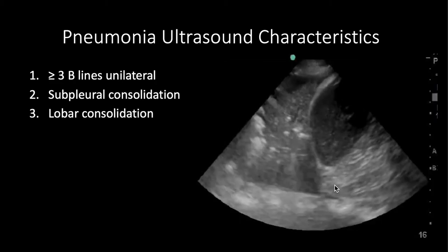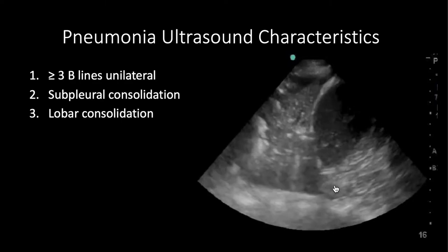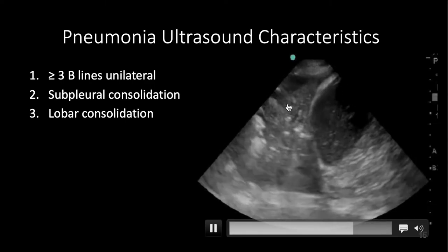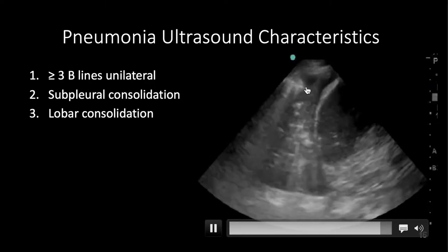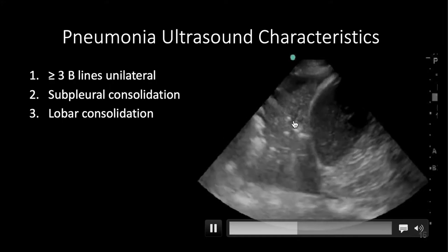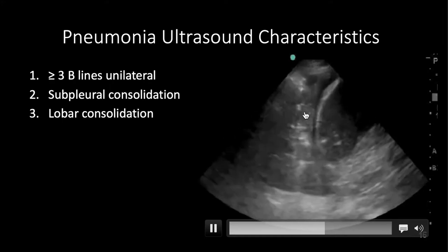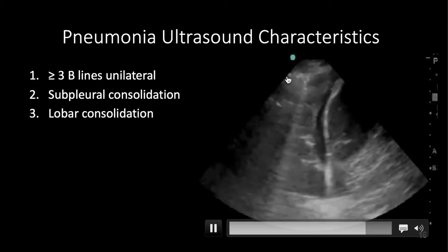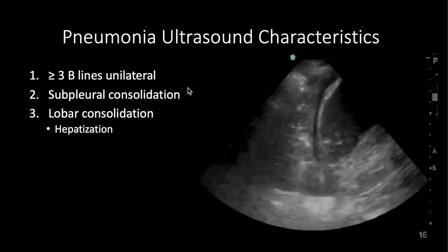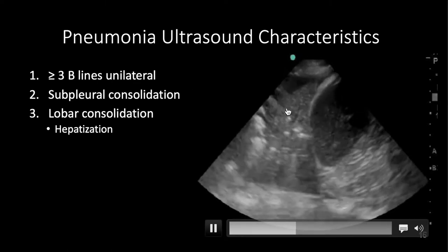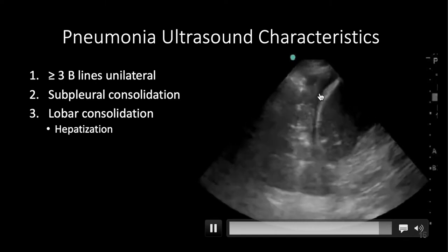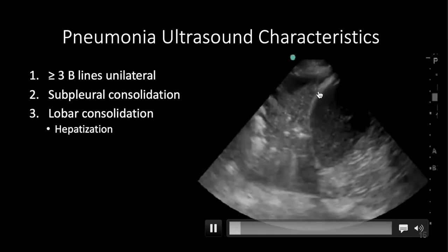When even more pus builds up in the alveoli, you get larger lobar consolidations. This is a severe lobar consolidation where the lung is filled with pus. As the patient breathes in, they bring a little more lung into view, which has B-lines. Some people call this hepatization of the lung, where the lung is behaving like a solid organ — just like the liver — because there's no longer air in the lung. It's all been filled with purulent, infectious material.